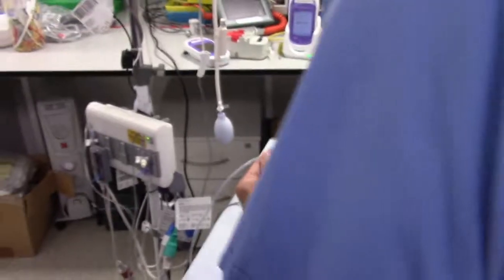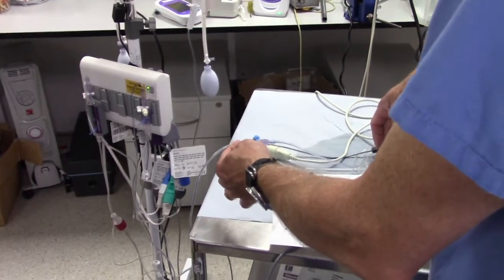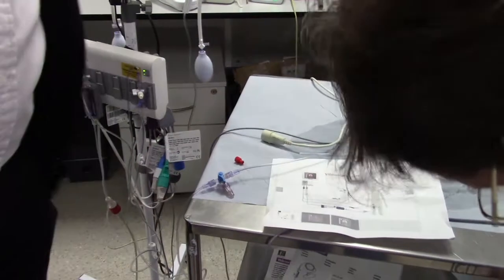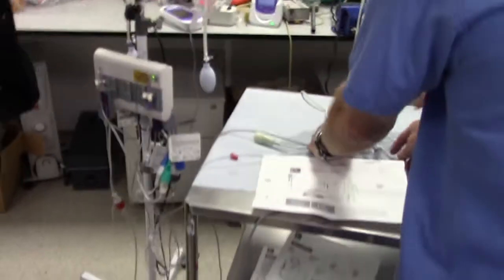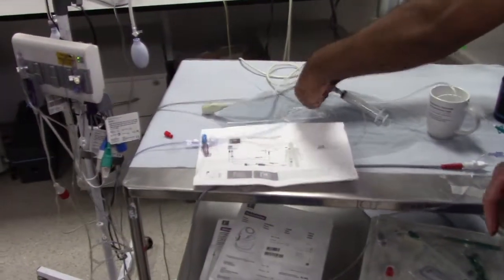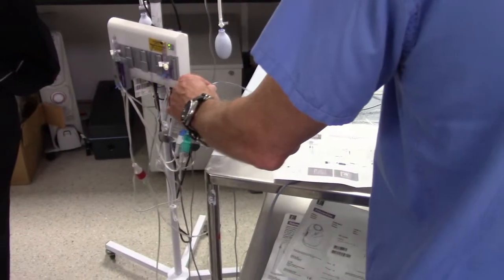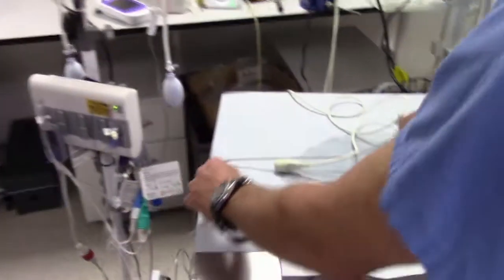Hang on then, how did they get that connected? Unless someone's fixed it, there's not one in there, is there? And on this diagram, this connection is just that bit there that goes straight on there. Yes, so they've added that piece in. Is it on this? Just twist and push it on. Okay, and that piece, what does it represent? Probably this one.